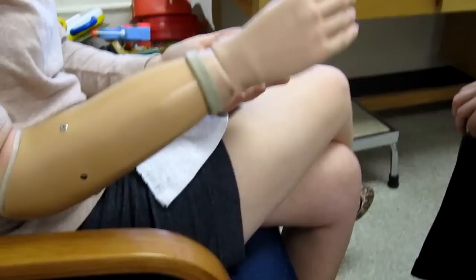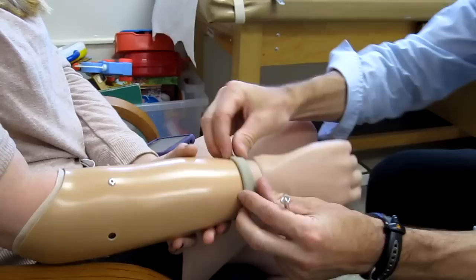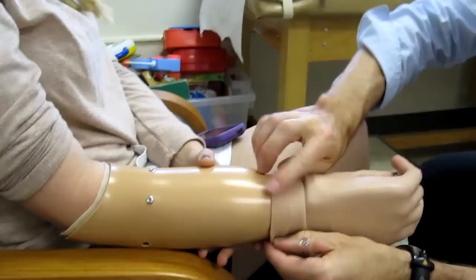You're doing great. They're not doing anything wrong. As far as this goes, I can cut this to whatever length. It'll lay flat if I just do it. I didn't know if there was a reason why you had that up like that — just because I had pulled it off earlier. That was it.